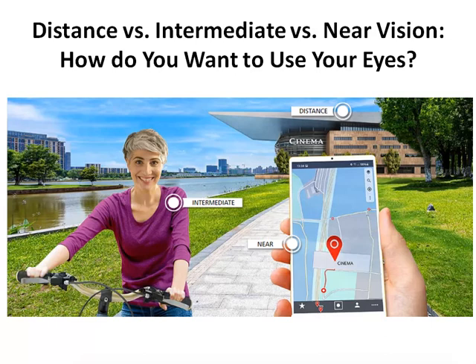Distance vision is what you use when you're focusing on something that's more than a few feet away. Most patients select to aim for distance vision with cataract surgery. This helps you see birds and trees, street signs while driving, a chalkboard in a classroom, and a movie in a theater. If you opt for distance vision, you should plan on needing reading glasses for near visual tasks.